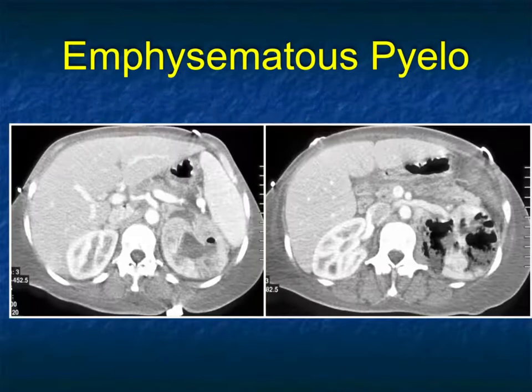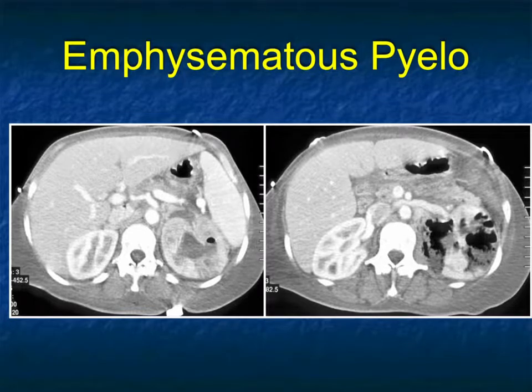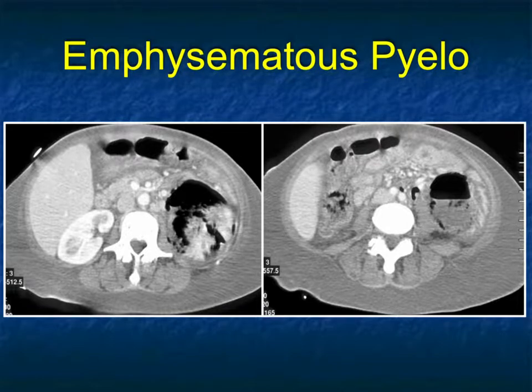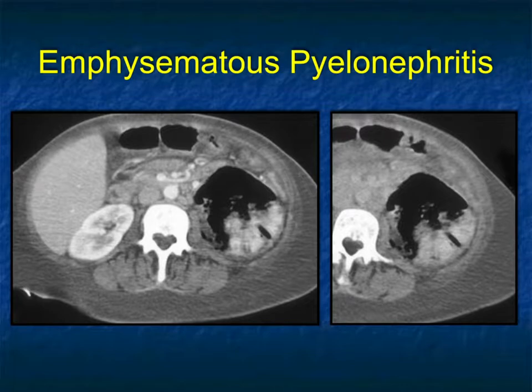Here's a great example of emphysematous pyelonephritis. Look at the destruction of the patient's left kidney — there is still some function present, but most of the kidney is destroyed with lots of air within it. The air goes beyond the kidney into the peri- and perirenal space. This is a surgical emergency. People have tried putting nephrostomy tubes in only because patients are often poor surgical candidates, but this patient would get a left nephrectomy. Here's another example where the left kidney is totally destroyed — this is emphysematous pyelonephritis, almost a pathognomonic diagnosis.